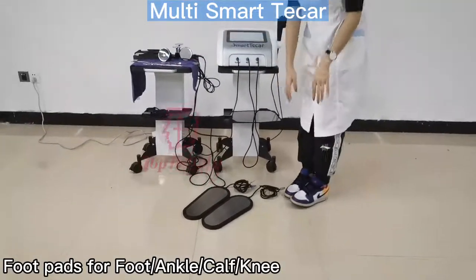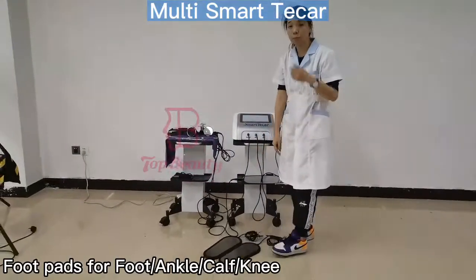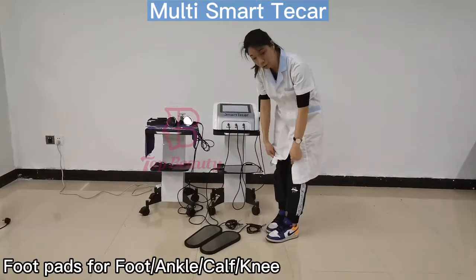So when we're doing the treatments, the two feet stand on these two packs, and then you will feel the heat from here to the knee.